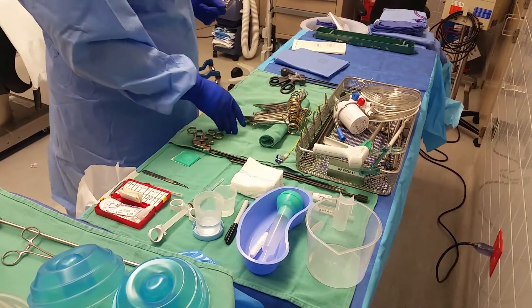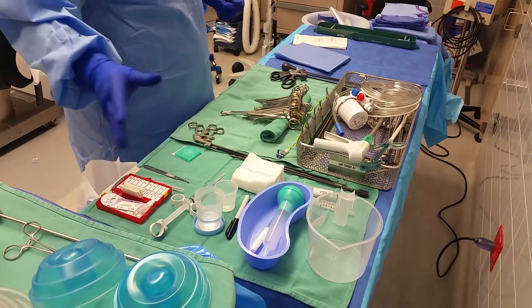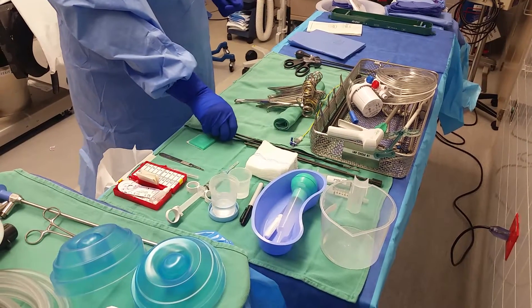And all your specialty stuff — your clips, endo pouch, your suction irrigator — you're not going to necessarily use them first, so I keep them in my tray. And my instruments that I'm going to use are in the case; I have them to the side of the tray.